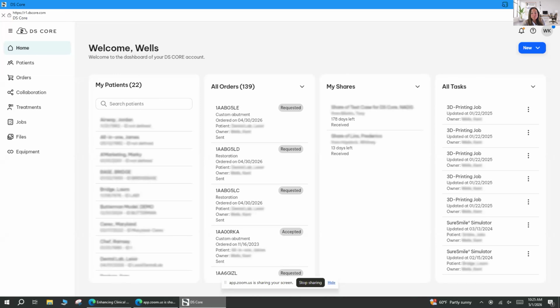Yeah, I think that's a good point. Sometimes when photos are lost or something is texted but it isn't sent immediately, that can delay things. We all know how important turnaround time is, and that's certainly something we strive to do our best at as a lab. I can see this definitely as a platform being able to streamline the communication process and minimize turnaround time. You'll get fewer calls from the lab saying you need X, Y, and Z, and then doctors say you already have it. So this kind of gets rid of that, which is nice.